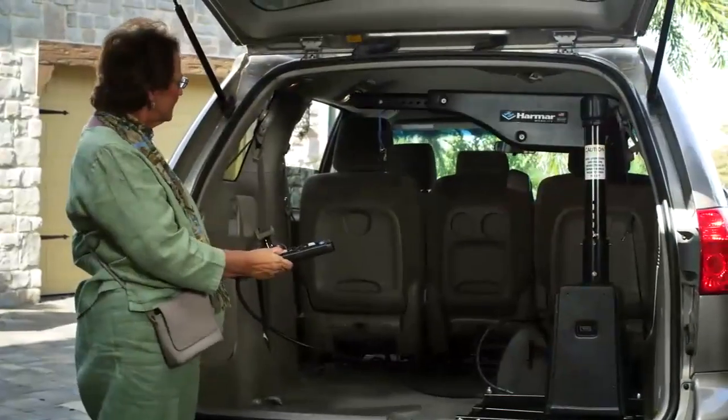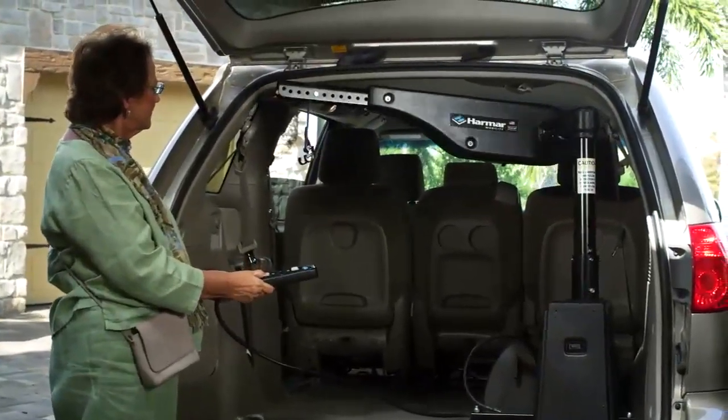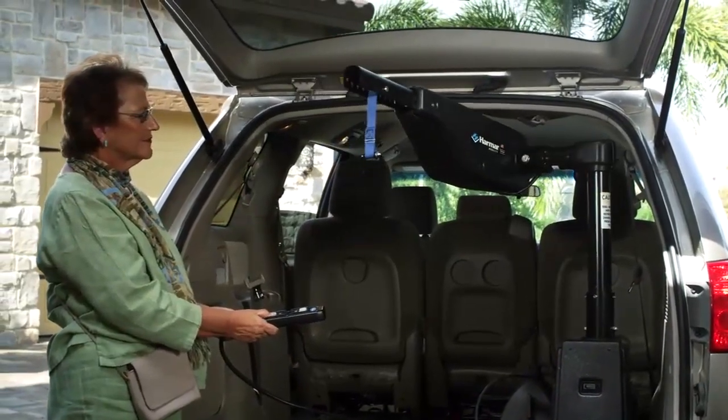To quickly load it inside the vehicle, Harmar lifts are simpler, stronger, lighter, and easier to use.